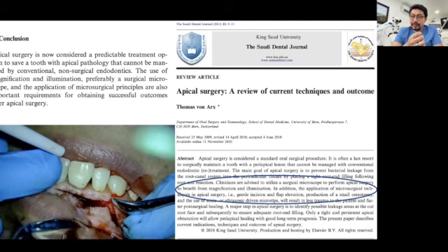The success rate of periapical microsurgery before the microscope was around 75%, according to some reports. Nowadays, we have a success rate of 95% in periapical surgery, which is the same success rate of a regular root canal treatment. Why? We have more precision, we have better abilities for providing a proper diagnosis, and it was the problem when we look into the past.